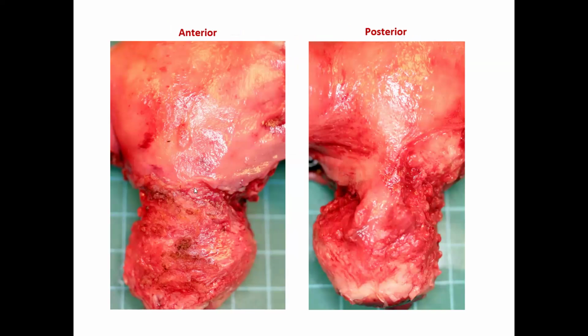Anteriorly, you can see how the serosa stops very high, but posteriorly, the serosa goes down all the way to the ectocervix. If I give you a uterus, you should be able to know which side is anterior and which side is posterior just by looking at what we call the serosal reflection.